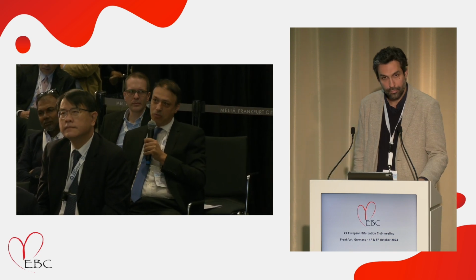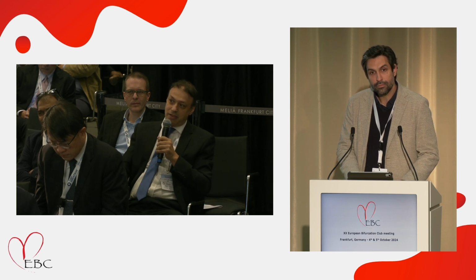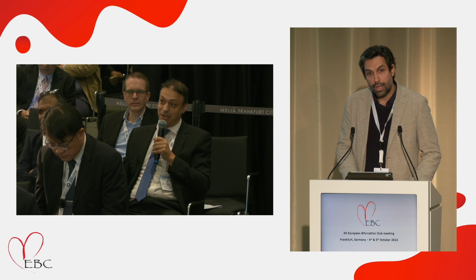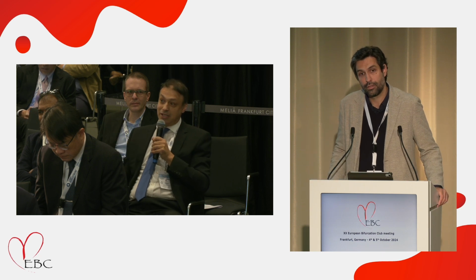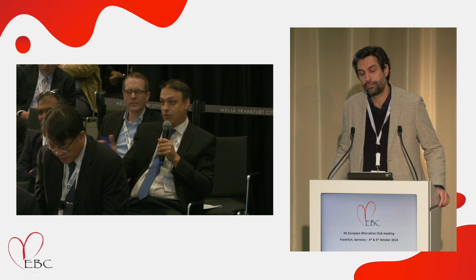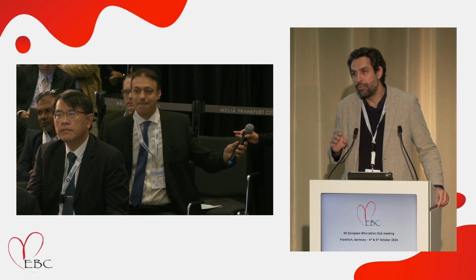I don't believe that CT does not have value in the cath lab, but sometimes we see different vessels after dilating a lesion, and missing some fibrotic plaques. And the calcification as well. You can see the calcium, but don't know where exactly it is, whether it's superficial or not. And most of these would be resolved with photon counting, of course. That's a very important comment, Chris.